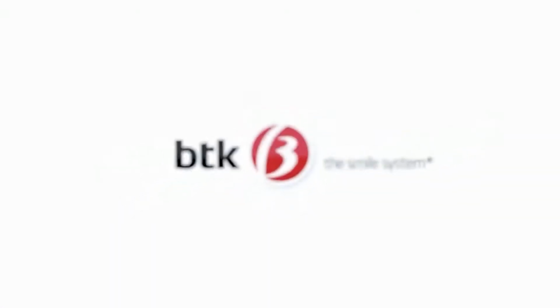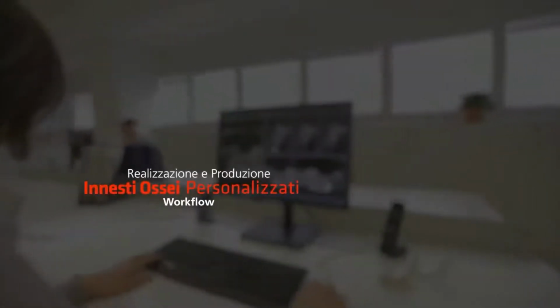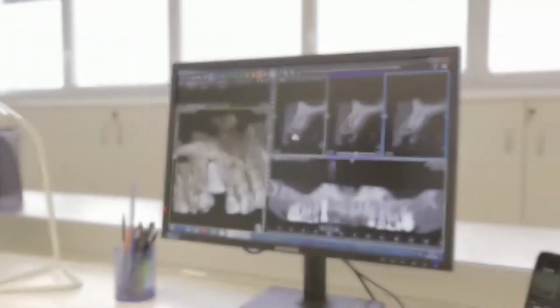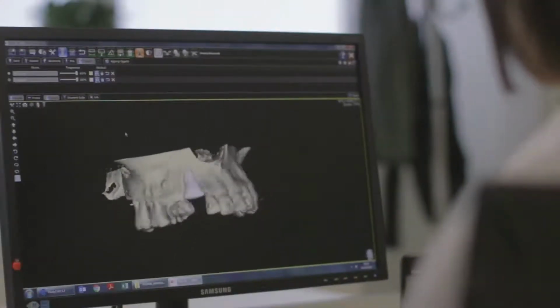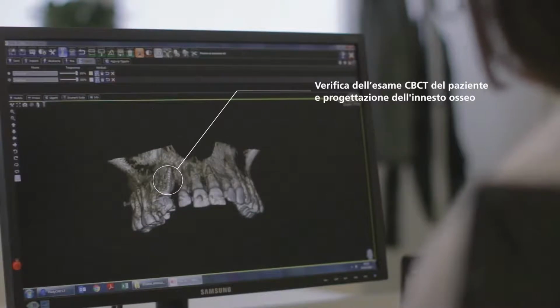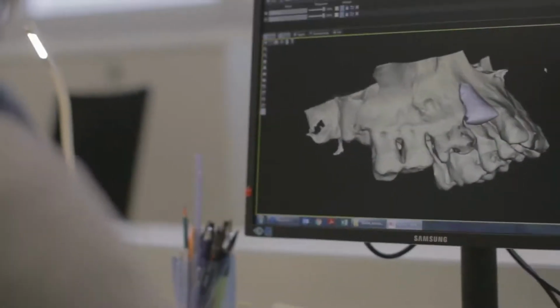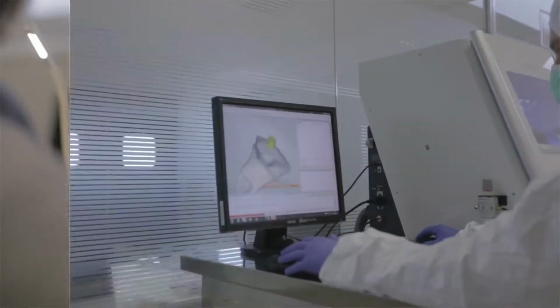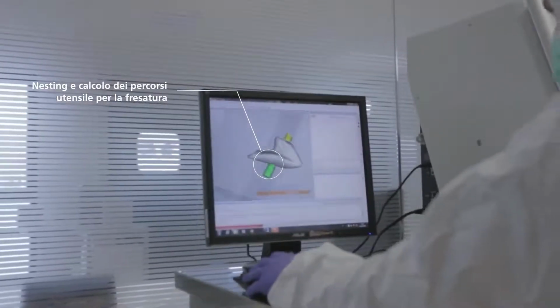Actually, we are working with this company, Biotech BTK. They provide an excellent service for the customization of computer-assisted design, computer-assisted manufacturing, hydroxyapatite beta tricalcium phosphate scaffolds. The material is called Regenera 3D. And basically, how does it work? You need to scan your patient and send the cone beam computed tomography, and if possible also the intraoral scan, to the service, in this case to the company BTK.